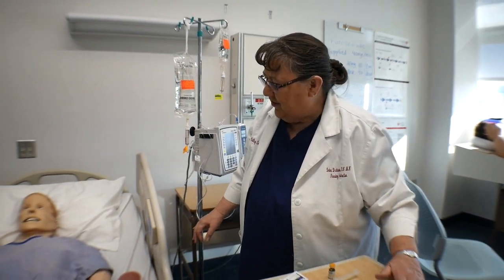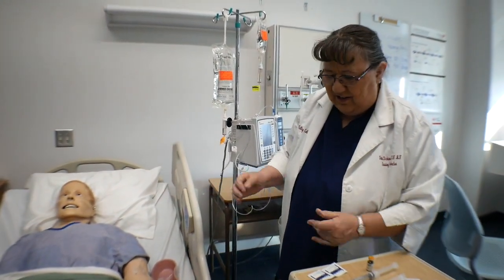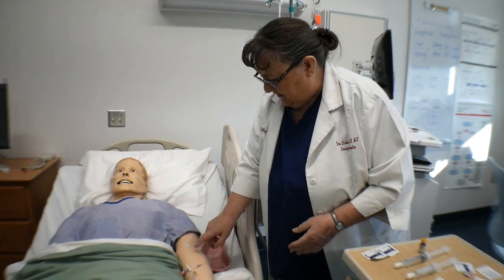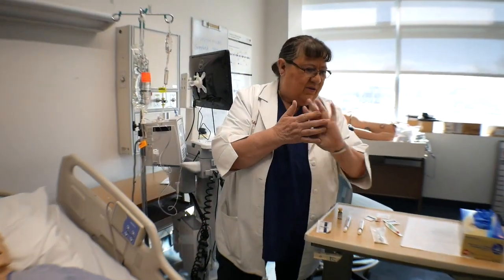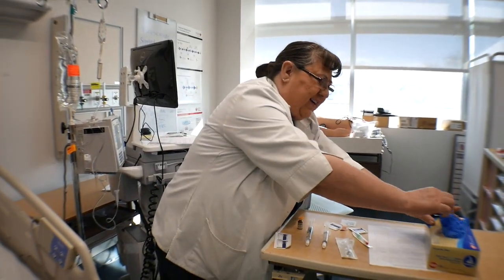And then I'm going to be giving you your furosemide today. So the other thing I want to check is make sure his saline lock is patent. Want to swipe in and out with my hands and put on gloves.